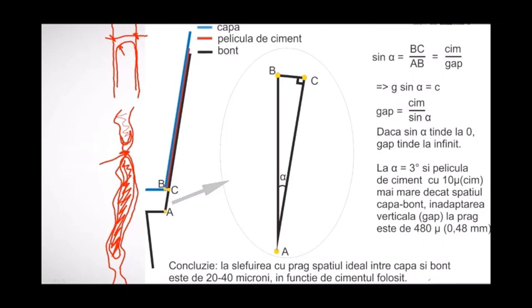You just tell the CAD, the computer-assisted design software, leave this space in between. And this is really to be found everywhere. It's so easy to work with digital technology today. Everybody has it in every single town. So yes, you go to 60 to 70 microns today.